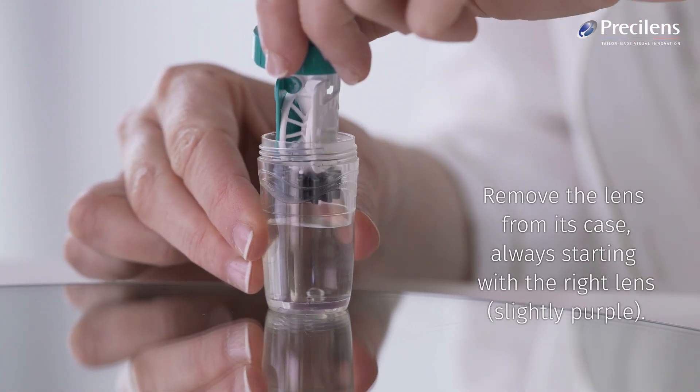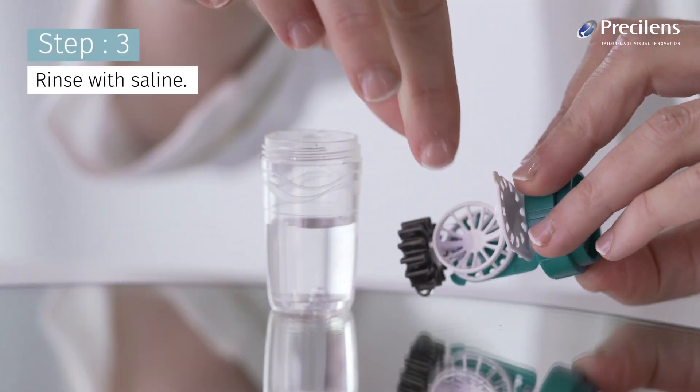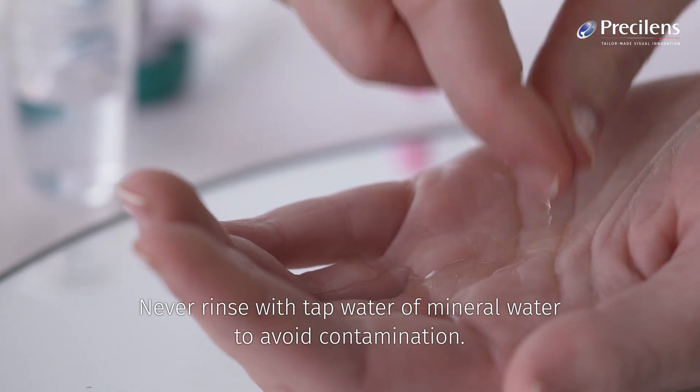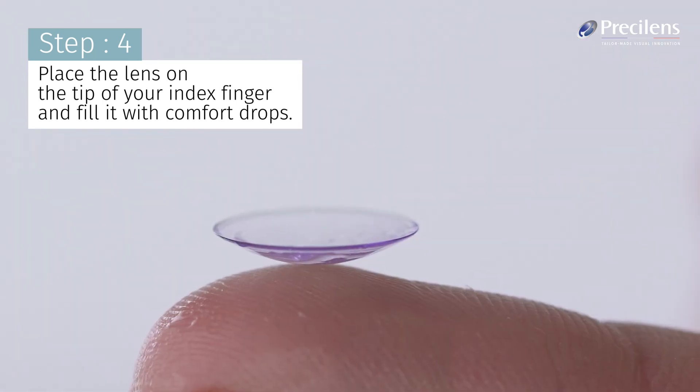Remove the lens from its case, always starting with the right lens, slightly purple, and rinse with saline. Never rinse with tap water or mineral water to avoid contamination. Place the lens on the tip of your index finger and fill it with comfort drops.